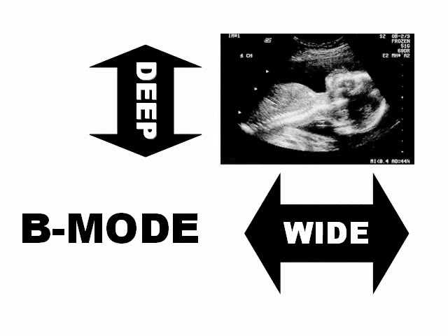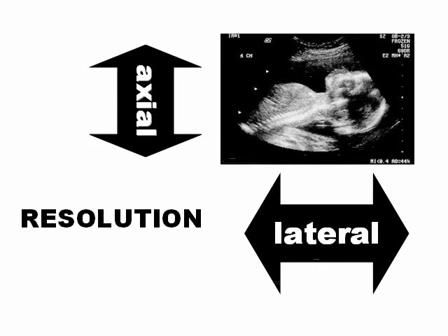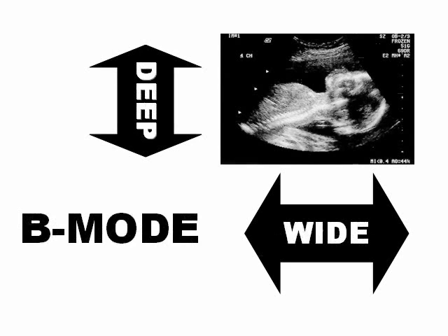It's a bidimensional mode, deep and wide, or the same, axial resolution and lateral resolution. Deep and wide, axial, lateral.